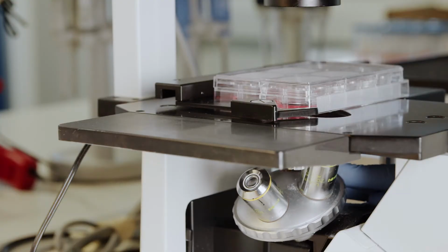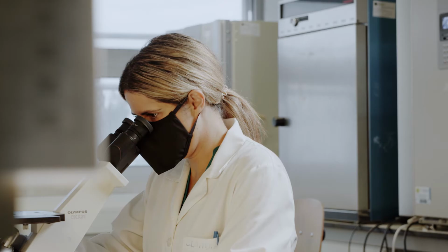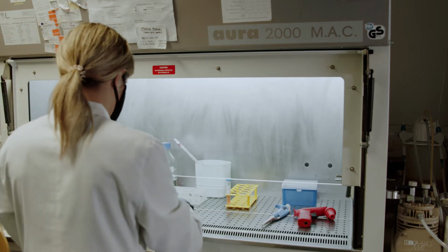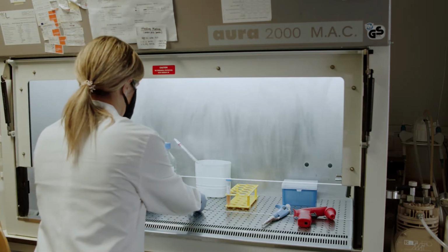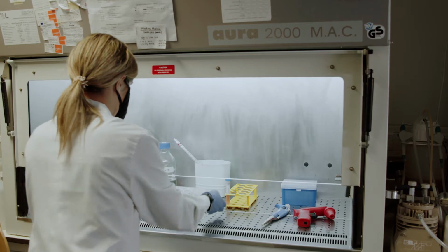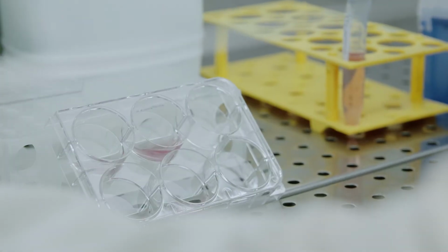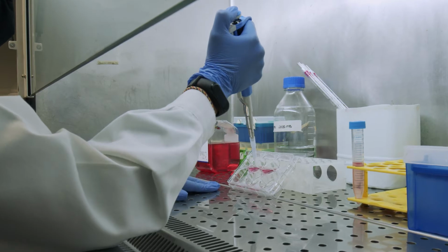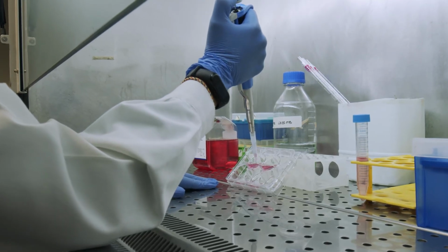The main challenge that we face when using suspension culture is aggregation. When we seed cells either into a culture plate or a spinner flask or a bioreactor, the first step that we really need to work on is the aggregation. Usually, using different culture media, we have obtained about 30% of cells that indeed aggregate. So there's a lot of cells that are lost in this process, and that's a challenge that we were able to overcome using the pluripotent StemScale.